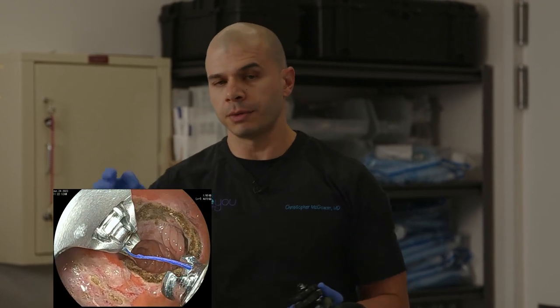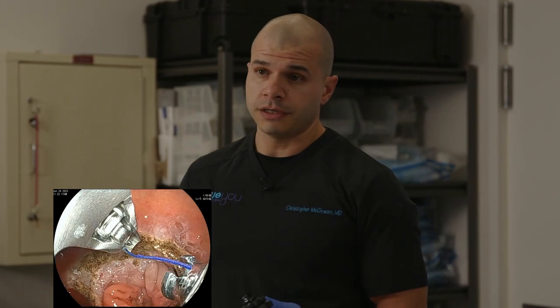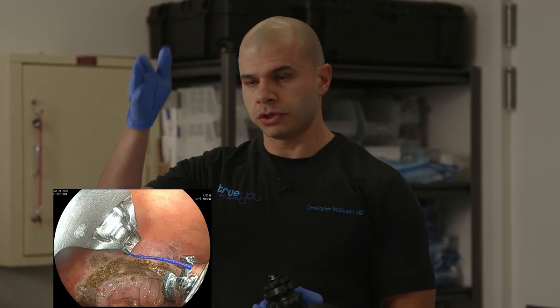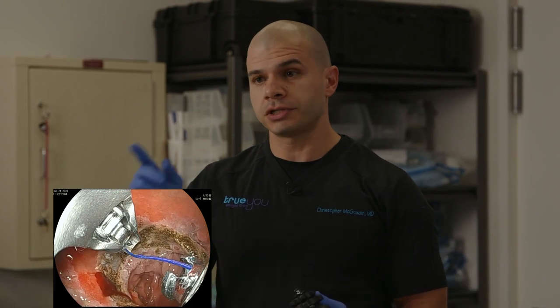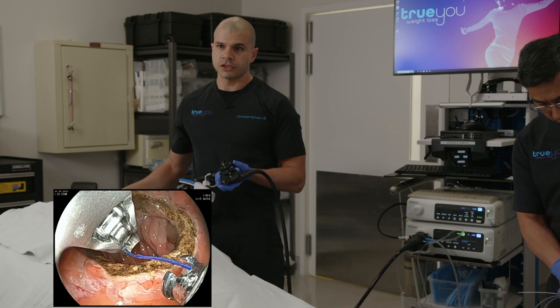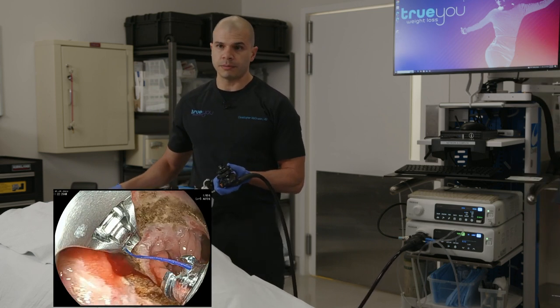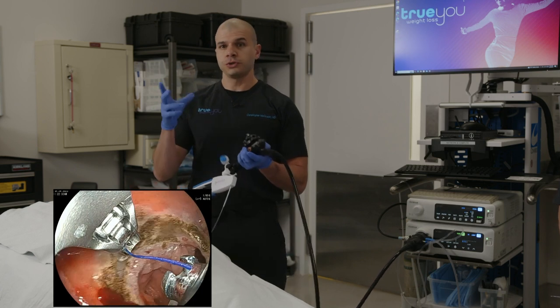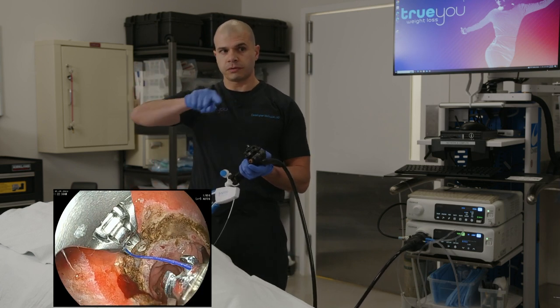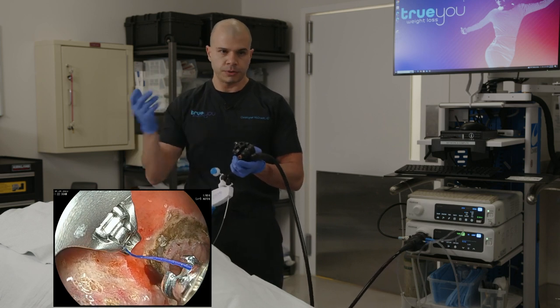So I'm going to perform a purse string suture. Now there's a couple ways that this procedure can be performed. Some people will use interrupted sutures, but what we know is that a purse string technique is more effective, meaning it leads to greater weight loss, it's more durable, and so we always want to aim for a purse string. We're quite particular about that in our program, and we do feel it's essential. Purse string suture, meaning we're going to suture all the way in a circle around one suture and then tighten that, just like you're tightening the string in a coin purse.